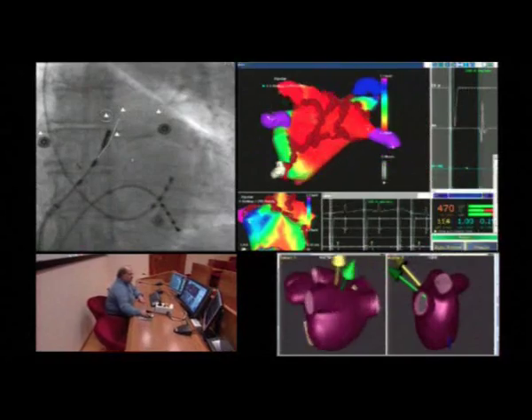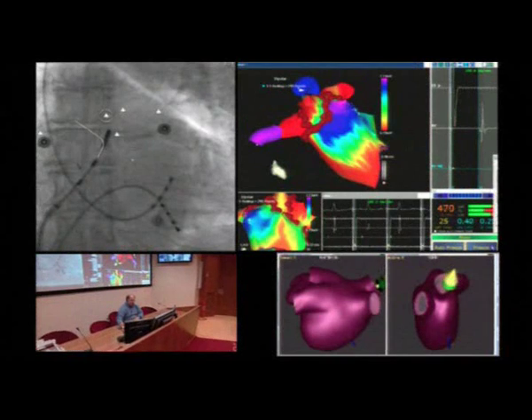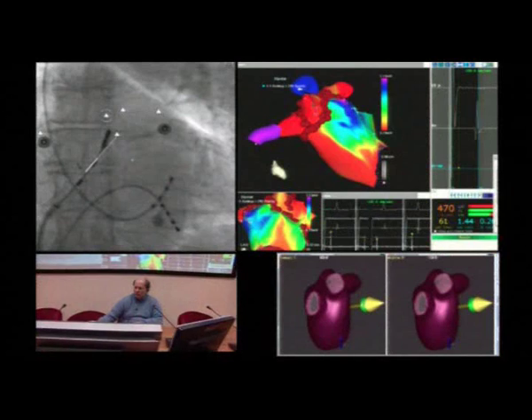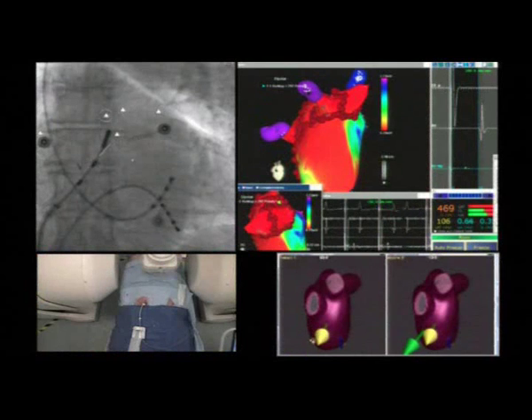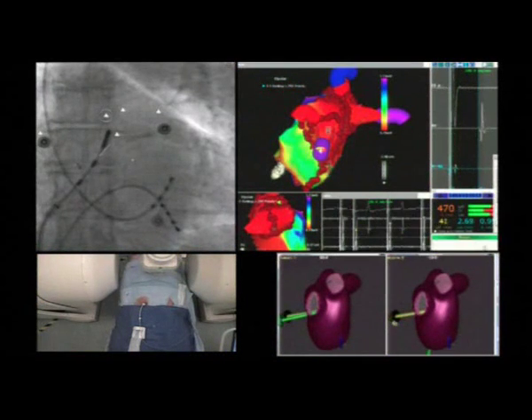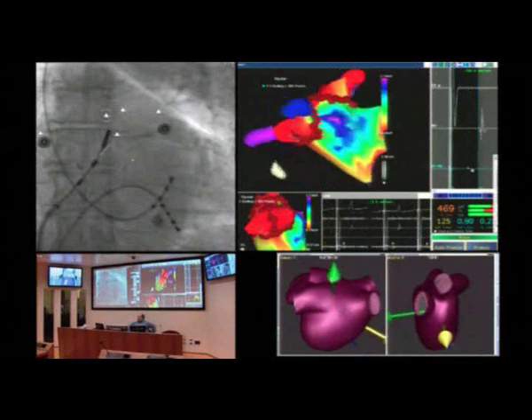To achieve this, we perform a point-by-point evaluation of the voltages on the ablation lines and inside the ablation areas. The possibility of performing high-density mapping on an accurate anatomical reconstruction avoids the bias in electrical evaluation due to the common malpositioning of circular multi-electrode mapping catheters.